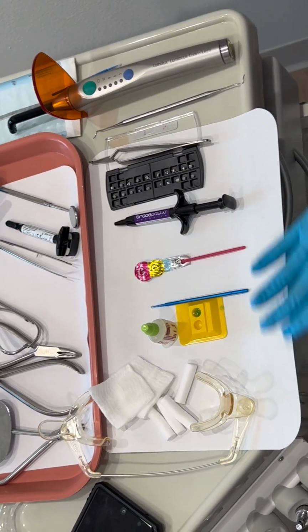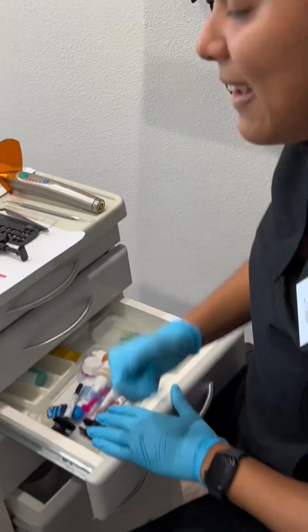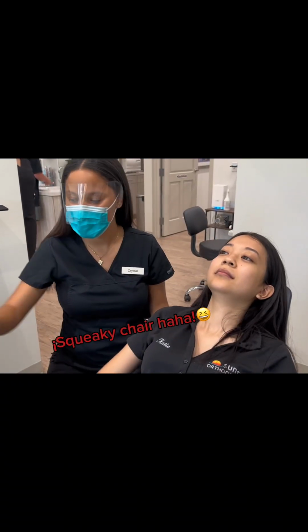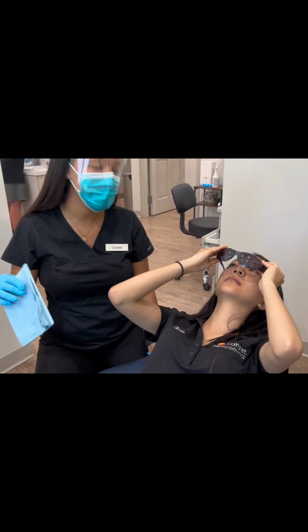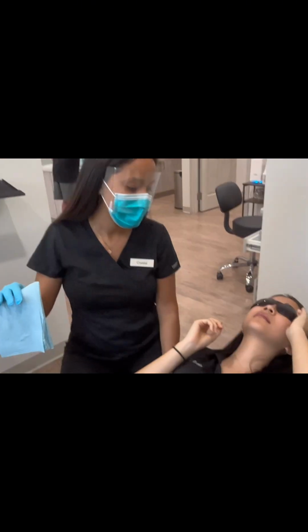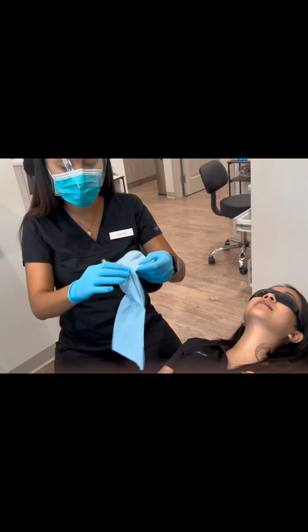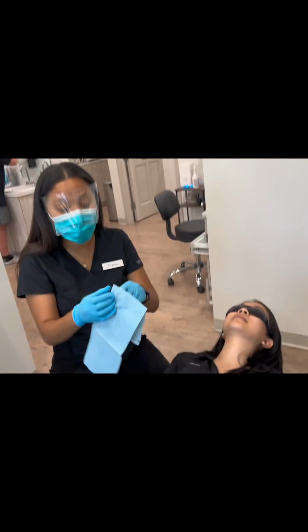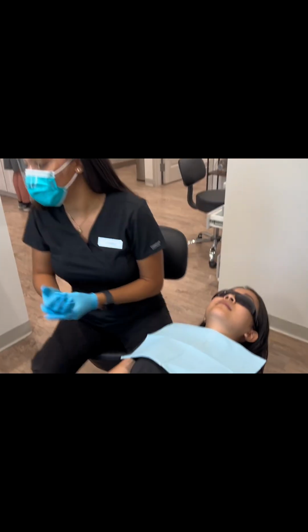This is the order. And you can take a picture of this if you want, so that you guys can kind of memorize it, and you'll see me go in order as I'm in the mouth. All right, so I'm going to get her started. So go ahead and put these glasses on. This is for protection of the eyes, and also if you do use the light for any reason, it does kind of give comfort to the patient so that the light's not in their face. But for the most part, it's for protection for their eyes. And of course the bib to protect their clothes, right?